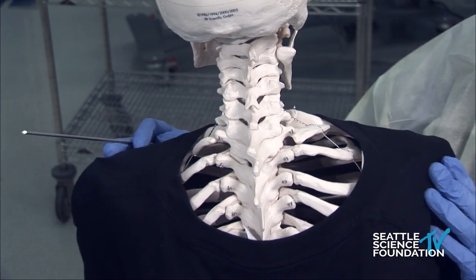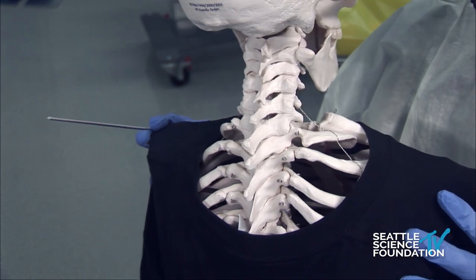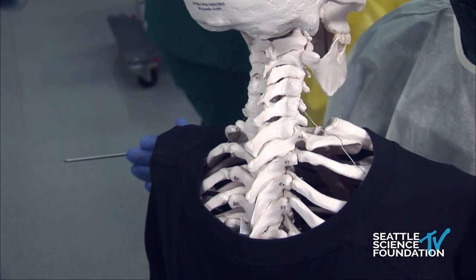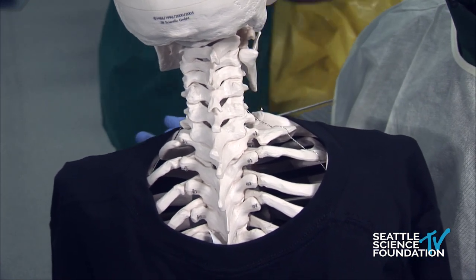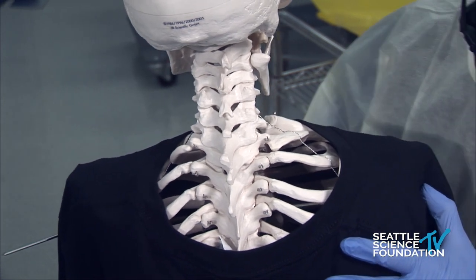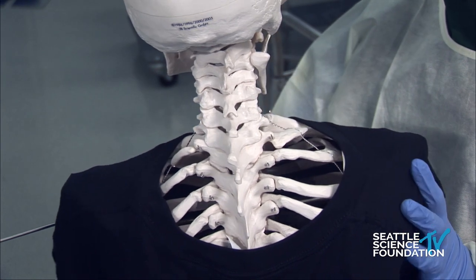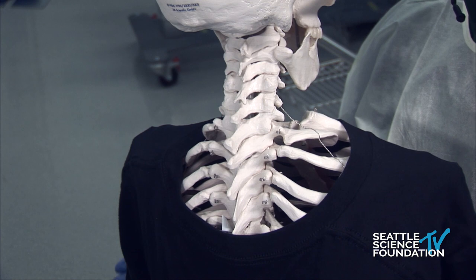So in order to ideally approach these when we are doing a radiofrequency procedure, the recommendation is to have a slight obliquity in your initial needle approach. That would be an obliquity in the range of 5 to 10 degrees from a true PA. When we have the cervical model on the table, what you'll see is that I'll start with an AP or PA position, and then I will caudally or cranial tilt the C arm so that I can see the scalloped edge of the facet joints optimally from the side. Then I'll have my X-ray technologist obliquify a fluoroscopic image by 5 to 10 degrees.